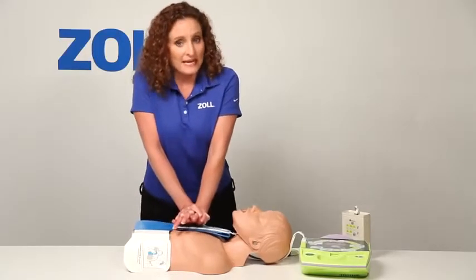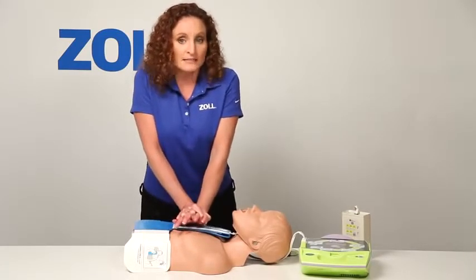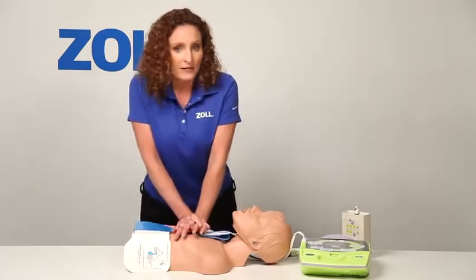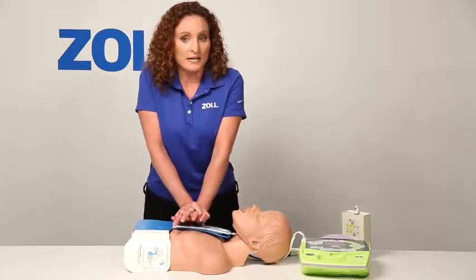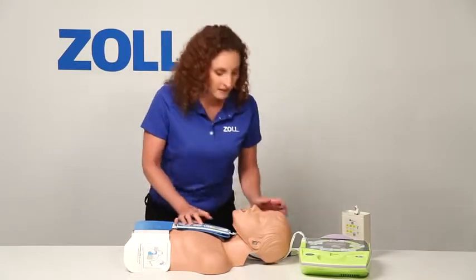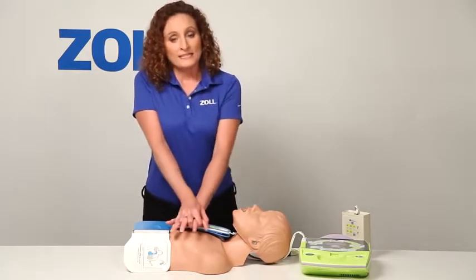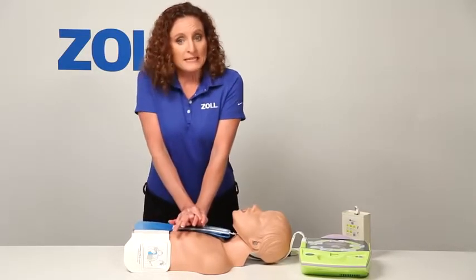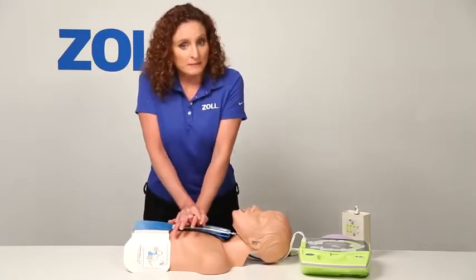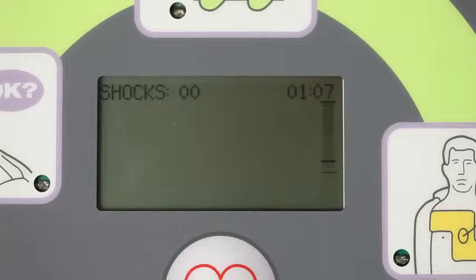The 2010 American Heart Association guidelines for CPR recommend a compression to ventilation ratio of 30:2 for trained lay rescuers. Untrained lay rescuers can provide hands-only CPR. If you do stop compressions, like I am now to give 2 breaths, the metronome stops. When I start back up, the beeps begin again and are synchronized to my compressions, and again speed me up to at least 100 compressions as recommended by the American Heart Association.